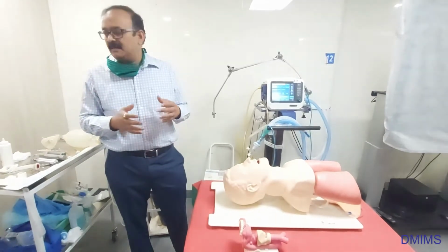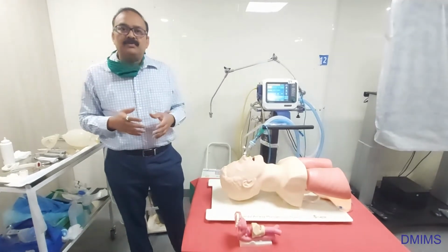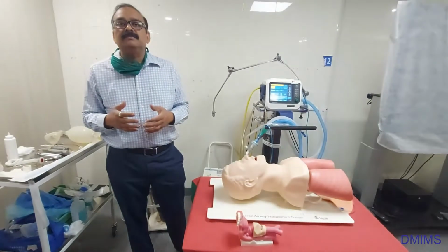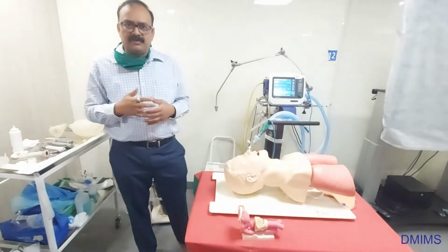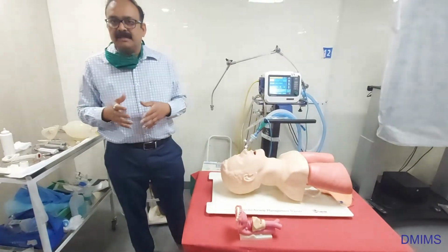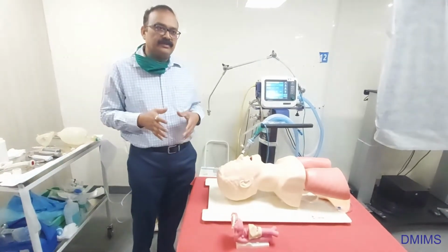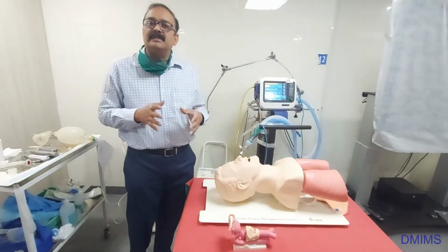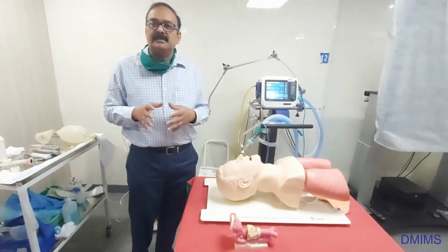In emergencies, there are life-saving conditions, when there is loss of the protective reflexes of the patient, and there is a chance of aspiration or of developing hypoxia. There are different conditions for that. But mostly we are concerned with intubation in elective cases. Elective cases are mostly done for the administration of general anesthesia, or in the setting of the ICCU.